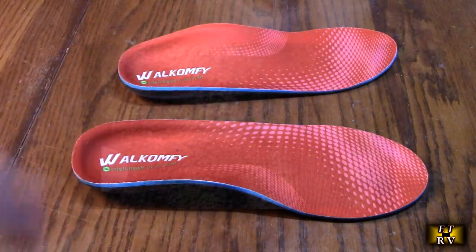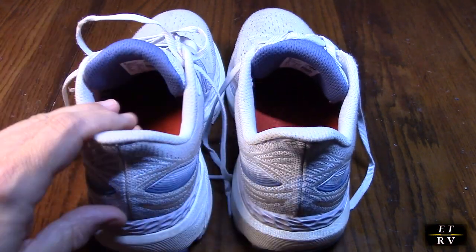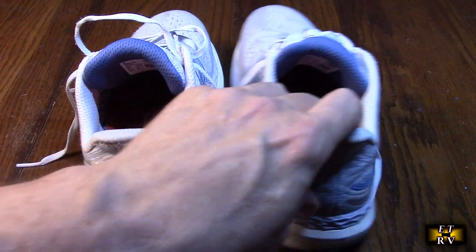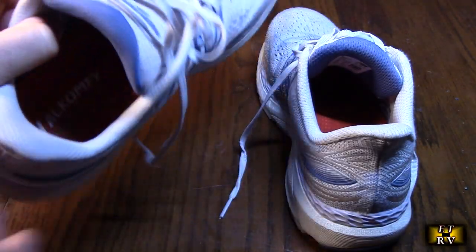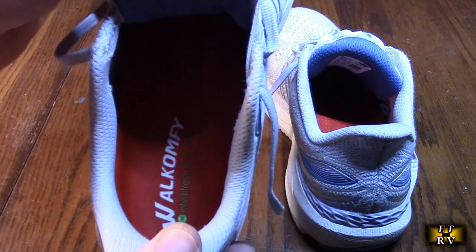My wife is going to be using them in these running shoes, replacing what was there which is all worn out and hasn't helped her. We'll see how she likes them. One nice thing about the Walkomfy brand is that you can buy all the different sizes for the shoe. My wife bought the size nine and they fit right in the shoe without any cutting — real easy to put in.